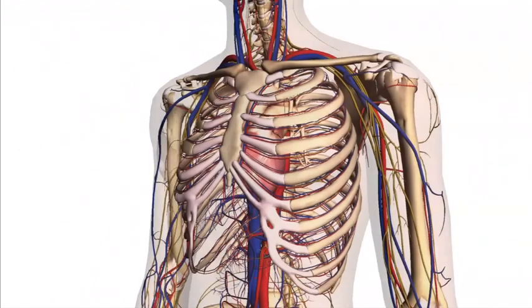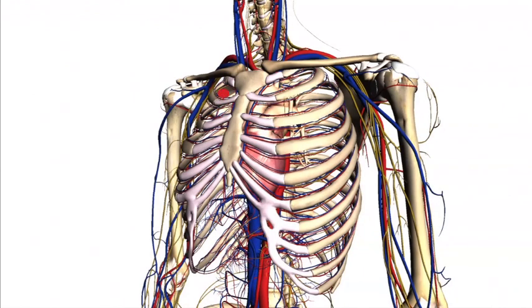For V1, using your fingers, count down the ribs to the 4th intercostal space, which lies between the 4th and 5th ribs, and place the electrode on the right sternal edge. For V2, again, count down the ribs to the 4th intercostal space, but place the electrode on the left sternal edge.